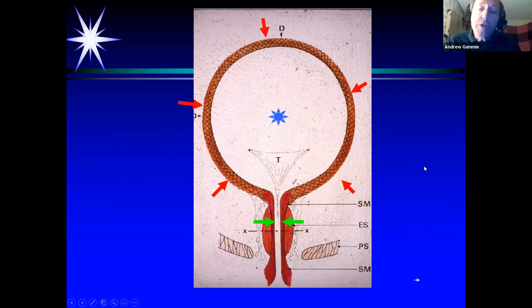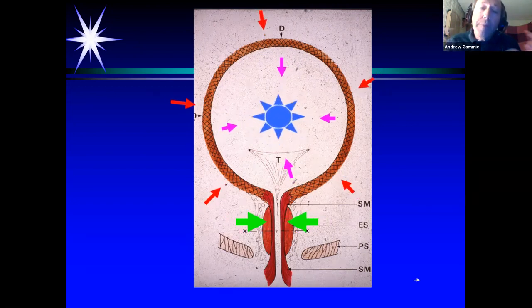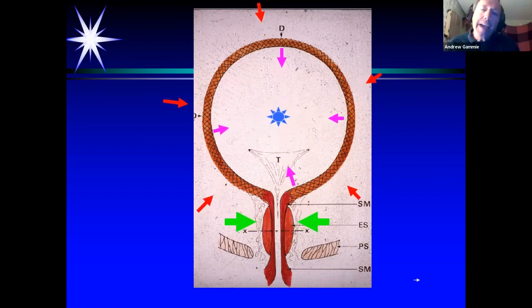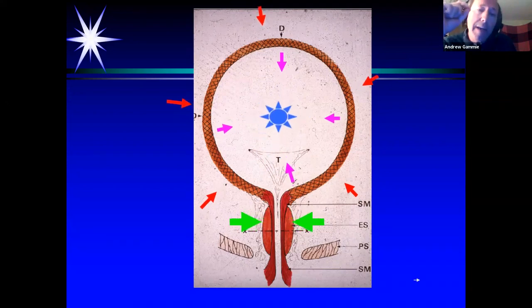Now, Marcus has already mentioned the two pressures we're looking at. One of them is the blue star, if you like. We called it PVES, or vesical pressure. And that blue star is changing, the pressure is rising and falling, according to the amount of pressure surrounding it in the abdomen. And when the bladder starts to contract, we then have a bigger pressure inside the bladder. That purple arrow is the extra pressure generated by the bladder as it contracts. And that's really what we want to know about in urodynamics.